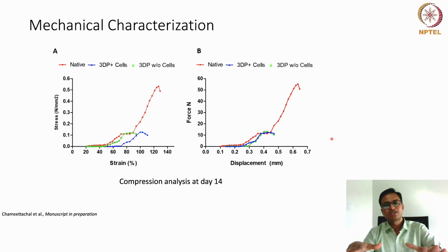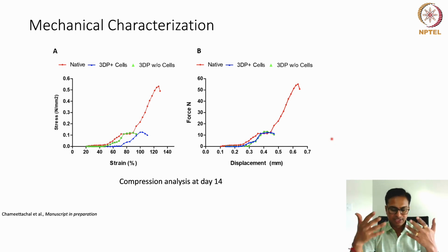And then we have put a contact bandage lens. Now we are doing further studies to understand whether this bioprinted cornea can be integrated with the existing stroma, and how this remodeling happens. After bioprinting, we can achieve up to 70 to 80% transparency.